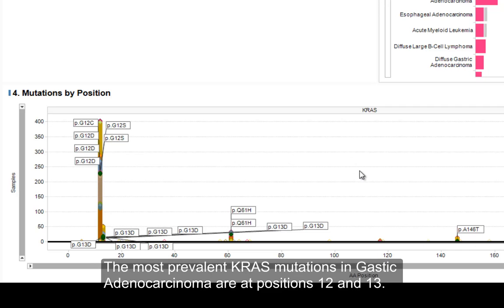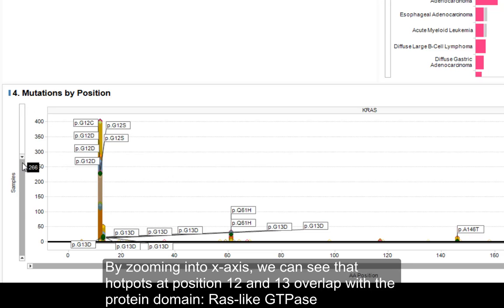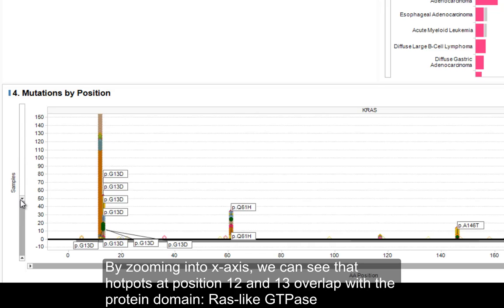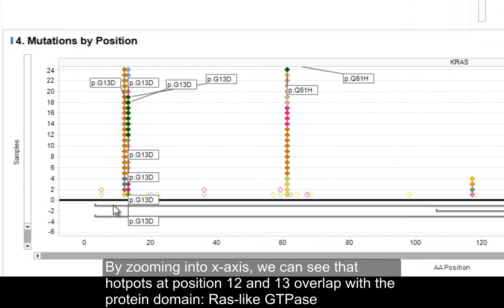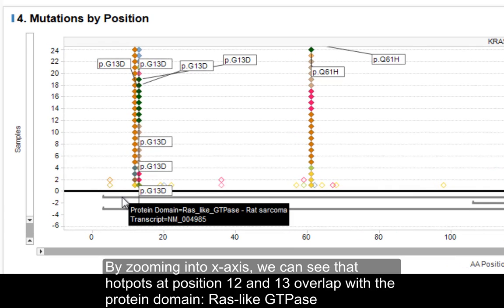We're looking to identify the most prevalent KRAS mutations in gastric adenocarcinoma. Position 12 and position 13 are the most prevalent. If we want to look at functional domains, we can zoom in to look in more detail, and we can see that positions 12 and 13 overlap with a RAS-like GTPase functional motif, or protein domain.